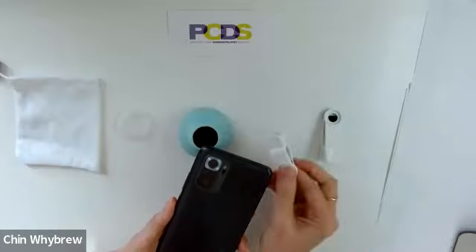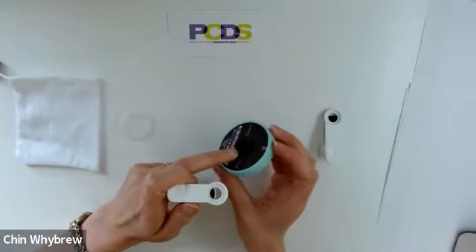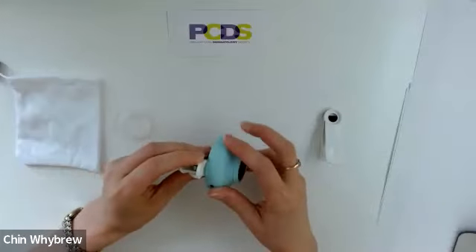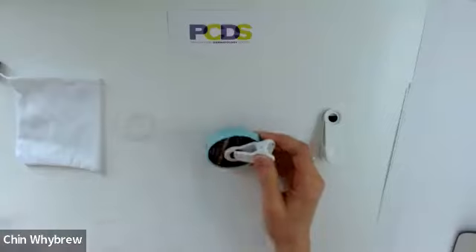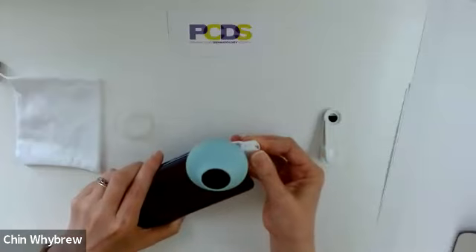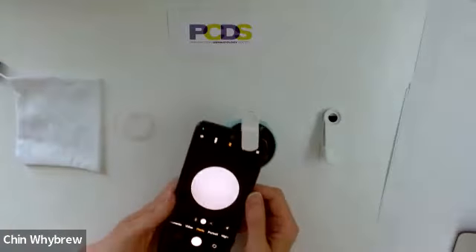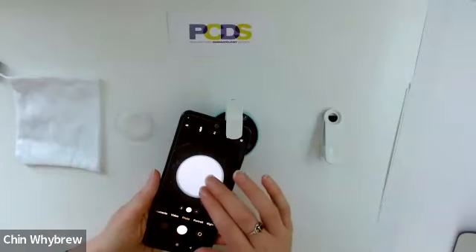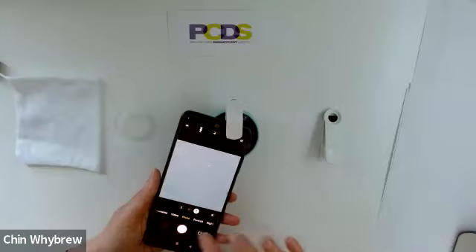I'm going to set it up for the smaller clip. What we do is attach the scope to the clip — there is a little thread here which screws onto the thread here, just like that, and that is now attached. Then I attach it to the phone, lining it up, put the phone onto camera mode, turn on the scope, and here we are. I can zoom in, tap on it to focus, and take a picture.